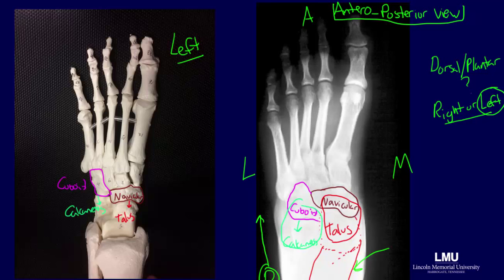The remaining bones of the midfoot are the three cuneiform bones, and they lie anterior to the navicular. The AP view shows the medial cuneiform, but the intermediate and lateral cuneiforms overlap somewhat in this view and are more easily evaluated on an AP oblique view. The medial cuneiform is shown in dark blue, while the intermediate and lateral cuneiforms are outlined together in black.